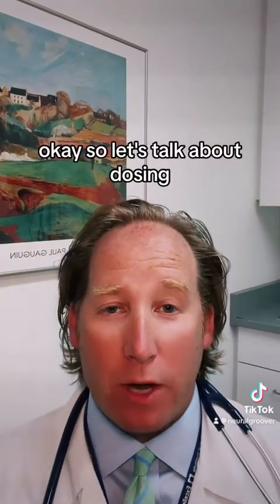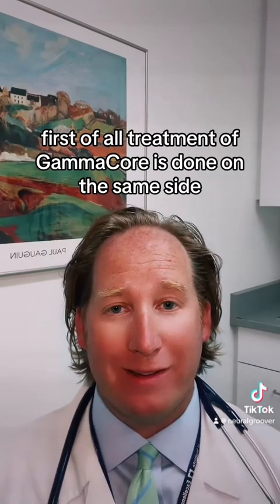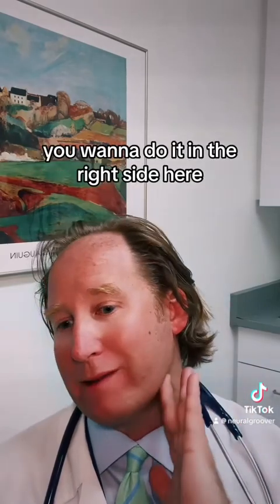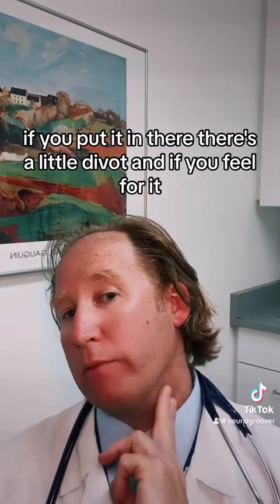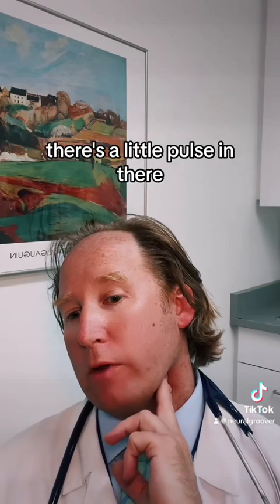Treatment with GammaCore is done on the same side as the predominant side of your headache — so if it's mostly right-sided, you do it on the right side. You find your carotid pulse just below the angle of the jaw. There's a little divot there, and if you feel for it there's a little pulse in that spot.